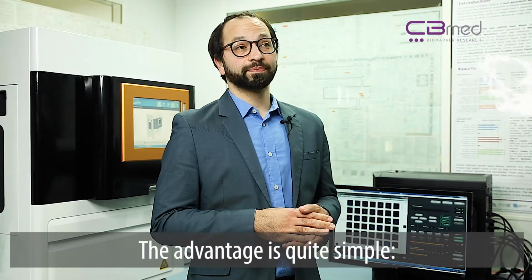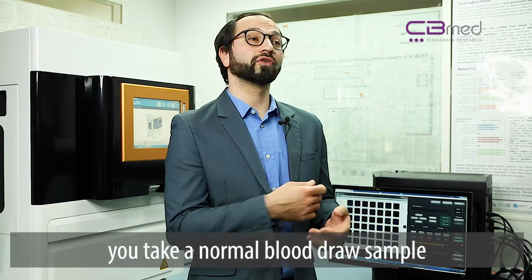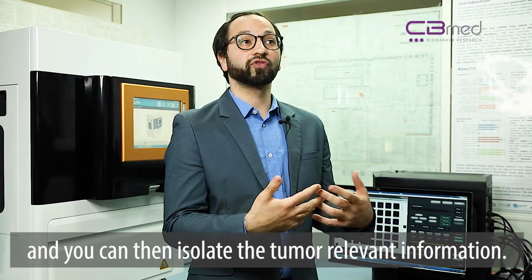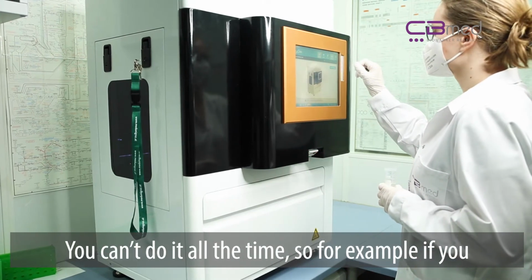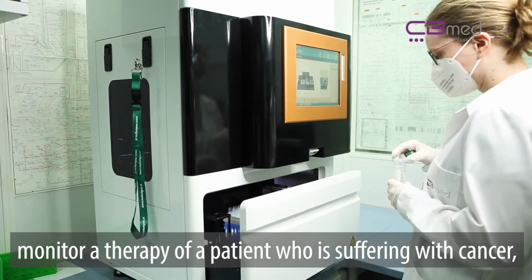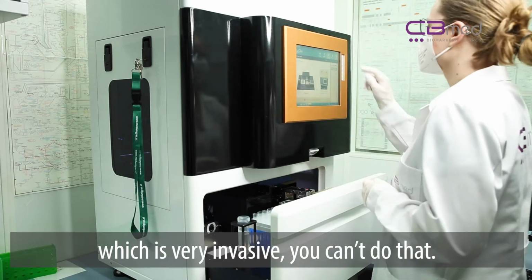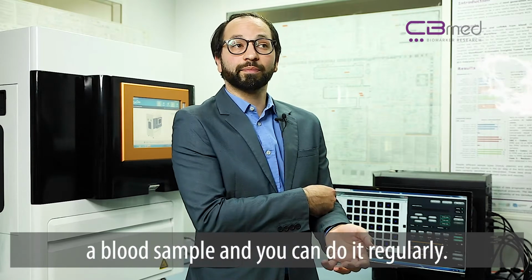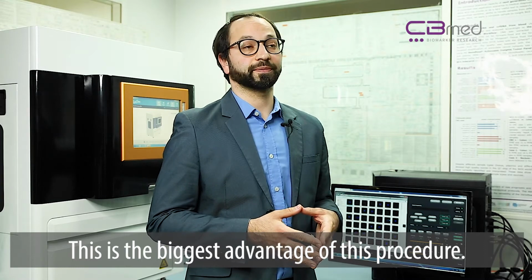So the advantage is quite simple. It's a minimal invasive approach, which means you simply take a blood draw. So you take a normal blood draw sample and can then isolate the tumor relevant information. Instead, the tissue biopsy is very invasive and you can't do it all the time. So if you want, for example, to monitor a therapy of a patient who is suffering of cancer, you would have to puncture the tumor every time, which is very invasive. You cannot do that. But with liquid biopsy, taking a blood sample, you can do it regularly. So this is the biggest advantage of this procedure.